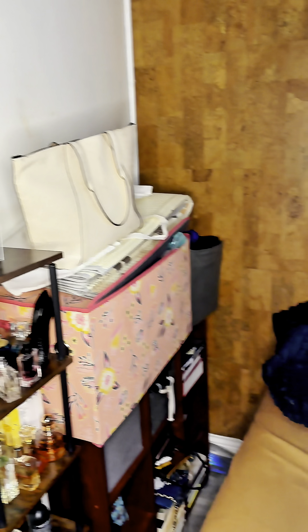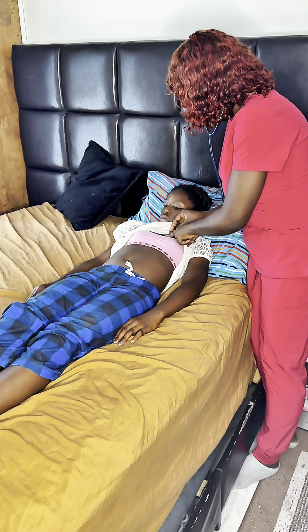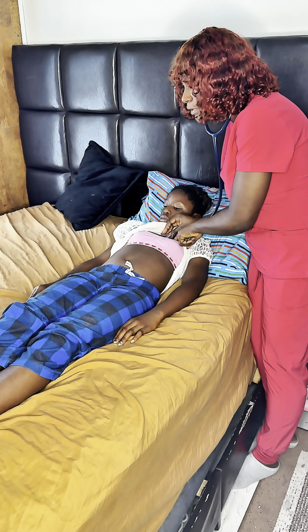First of all, I am going to use my diaphragm, and I'm going to go to the intercostal space and listen to the aortic. S1, S2 present. I started at the right second intercostal space for the aortic, and there is S1 and S2. I am going to the left intercostal space, and I'm listening for the pulmonic. S1 and S2 present.